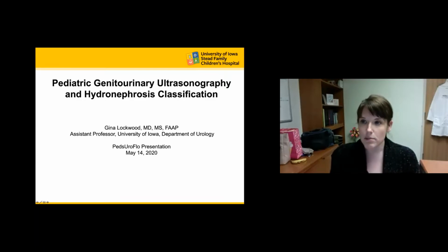I selected a broad topic today, and something that I am sure you are all very well versed with. I am going to talk about ultrasound in peds urology, and specifically the latter half of the presentation is going to focus on classification of hydronephrosis.